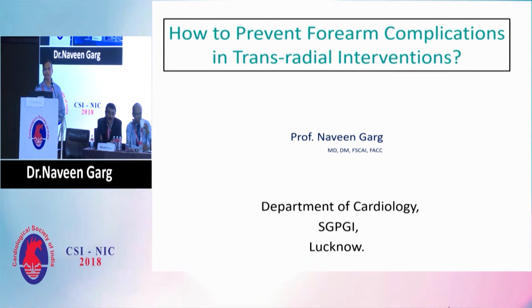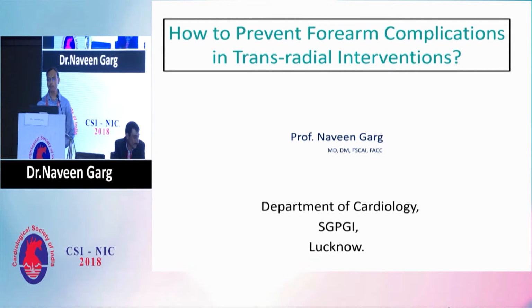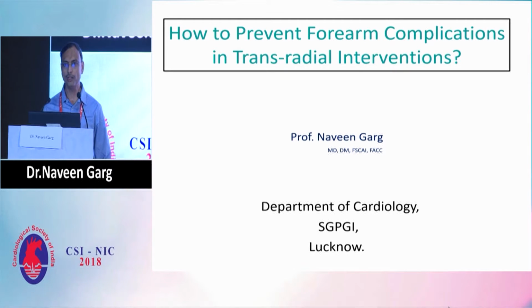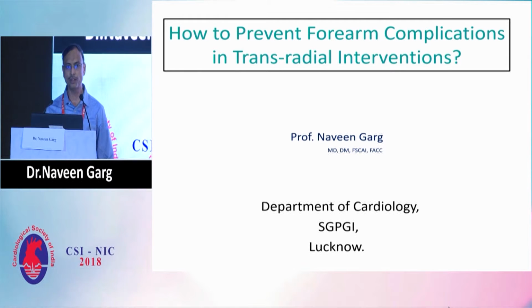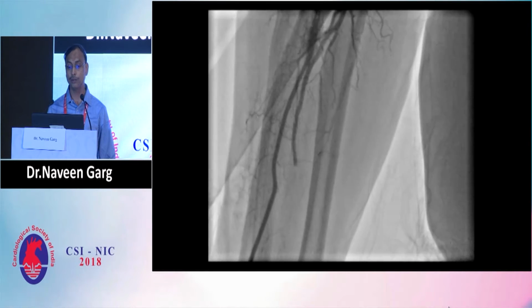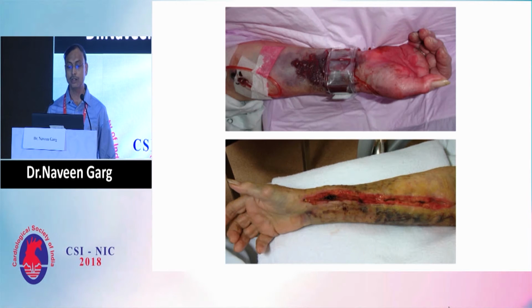Good evening, everybody. Today I shall be discussing how to prevent forearm complications in transradial interventions. And I will be focusing on a very simple, newly developed technique to prevent forearm complications. There are so many complications which a patient can develop after transradial PCI. The commonest are radial artery spasm, access site hematomas, forearm hematomas, and radial artery occlusion. And this is the main culprit. If you cannot treat that complication, the patient may develop compartment syndrome, and it can be a catastrophe.